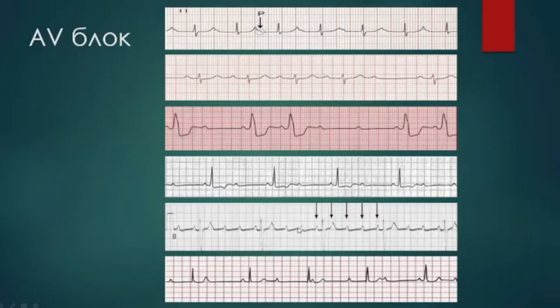You can have as much as you can think of, but there are some P waves which are conducted, and it's called high degree AV block. The situation here and the situation here. So several P waves are not conducted.